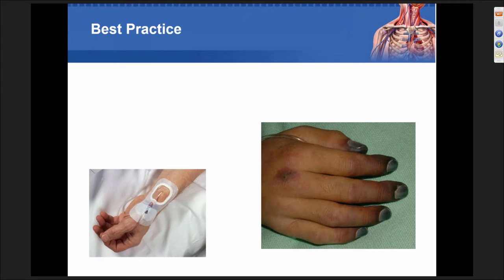And on the opposite one, the tubing again is over the thumb, but look at the fingers. If you walk into a room and your blood pressure doesn't match your cuff, they're telling you to fix your blood pressure, your waveform's not that great, and those are the fingers that you see, you really need to move positions and get out of that. Think about volume resuscitation. Think about how much inotrope and vasopressin and medications we're on to support this blood pressure, and see what can be titrated to optimize circulation in that extremity. Very, very, very important.